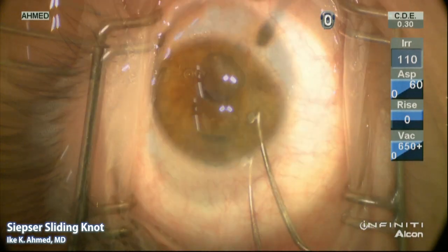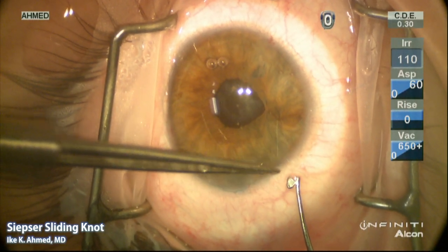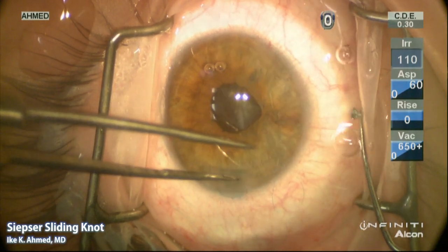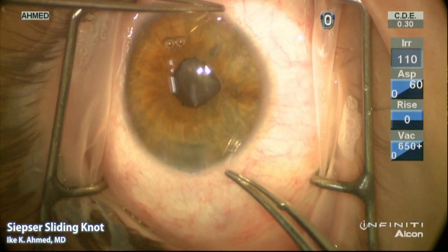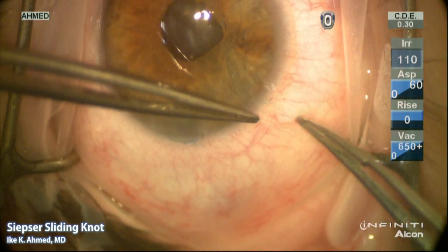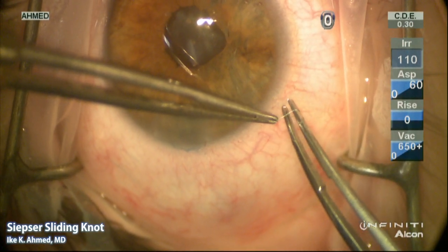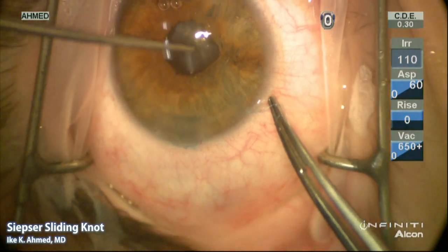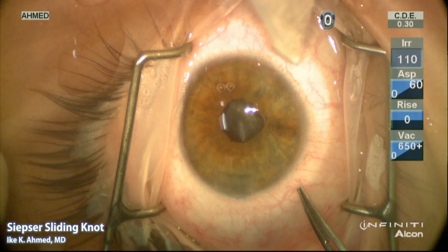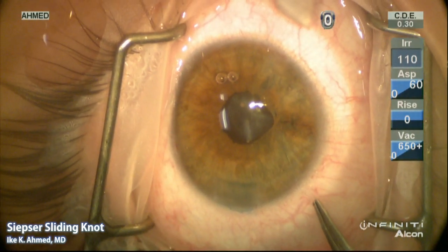The Kugeln hook is then used again to create a loop of the distal strand emerging through the proximal paracentesis, and here we see the loop adjacent to the proximal strand. It's important to ensure that the distal strand is still visible through the distal paracentesis. A reverse single throw of the distal loop is made to grab the proximal strand, and the distal strand is pulled to slide the distal loop along the proximal strand, tightening and locking the suture in place.